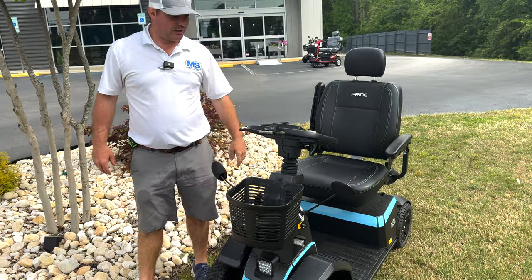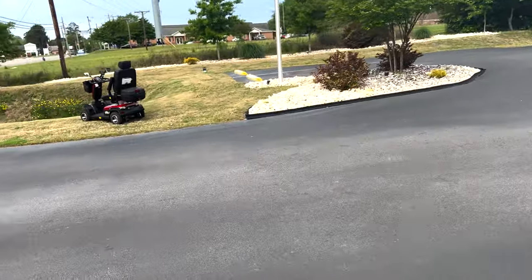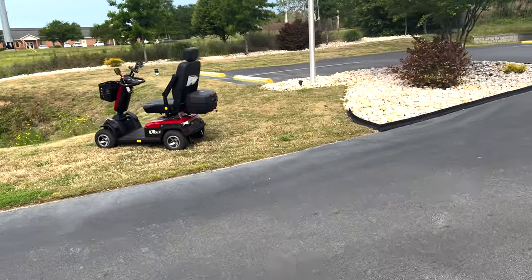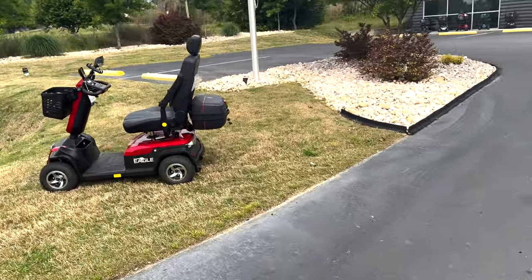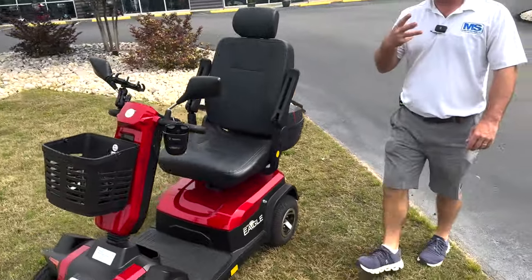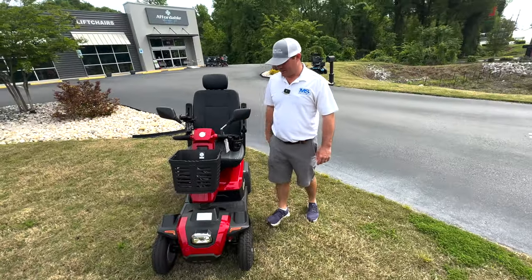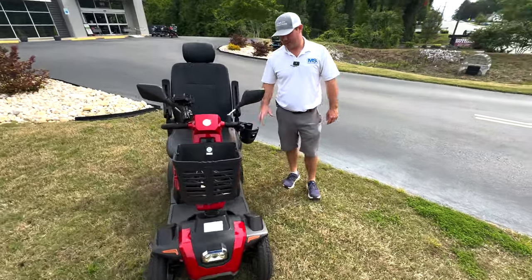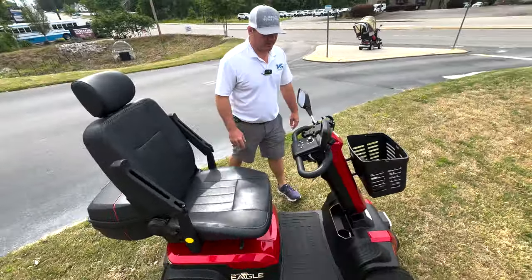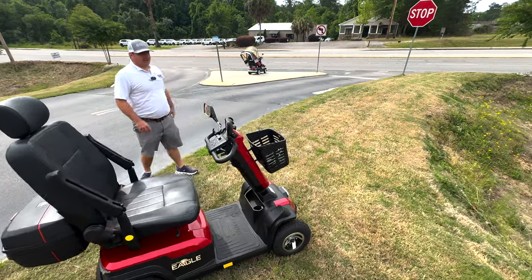The Golden Eagle is a very well-priced 500-pound weight capacity four-wheel scooter that has done excellent at Carpenter farms. It's got a full light package and comes with a back bag. Now it has three colors to choose from — red, desert sand, and gray. I think I just shipped one down to Florida in desert sand.